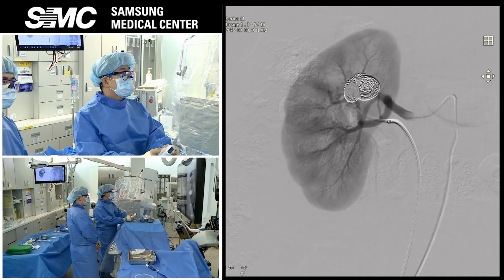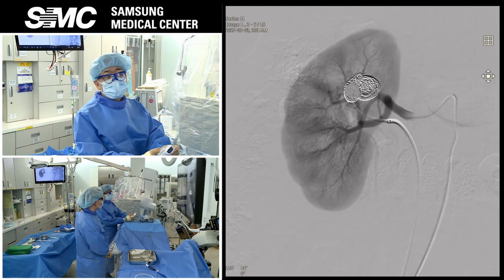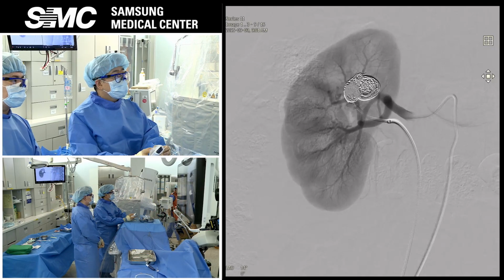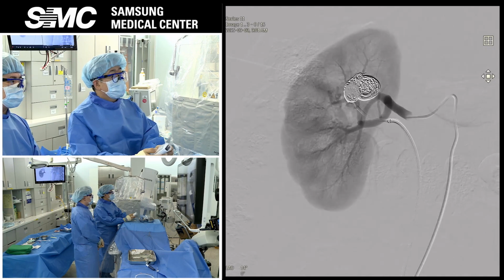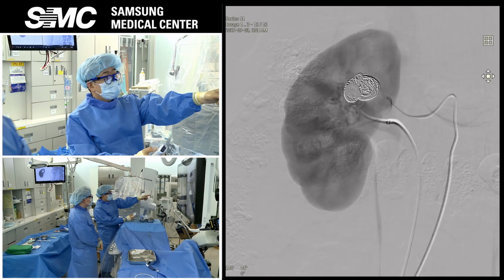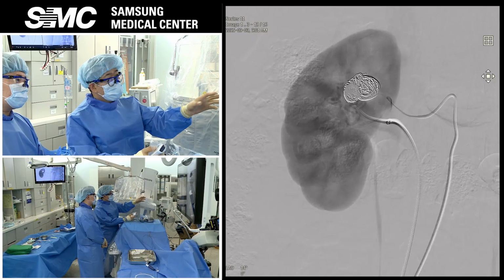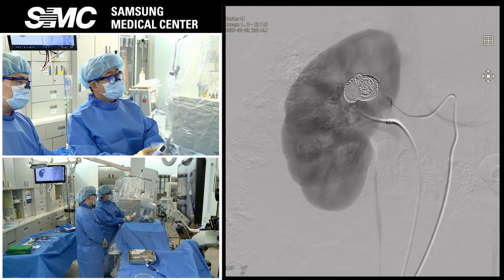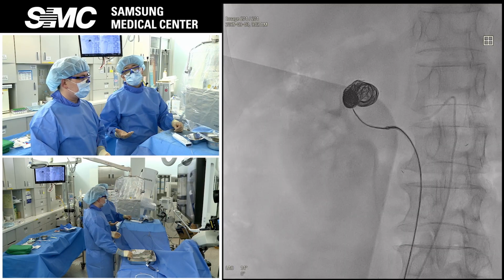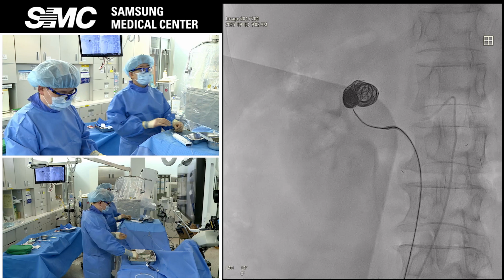During the procedure, we checked the arterial angiogram, and the flow slowed down, and this angiogram shows the AVM almost disappeared. As you can see in the delayed phase, there is an unthrombosed feeding artery around the AVM nidus, but I believe it will be thrombosed spontaneously after the embolization. Do we need additional coils or just stop the procedure? Do you have any recommendation?